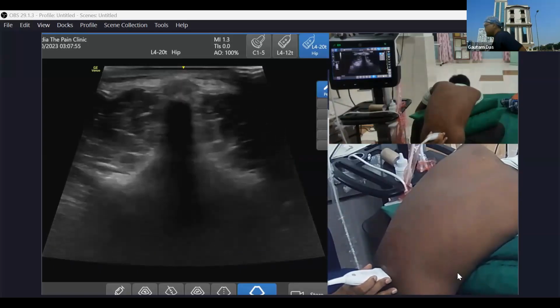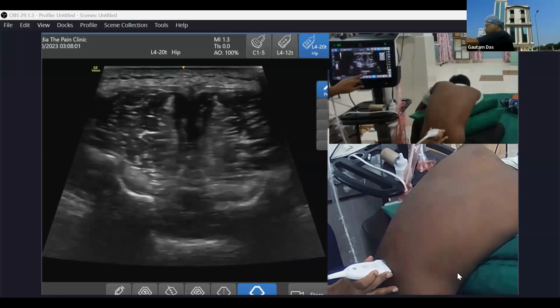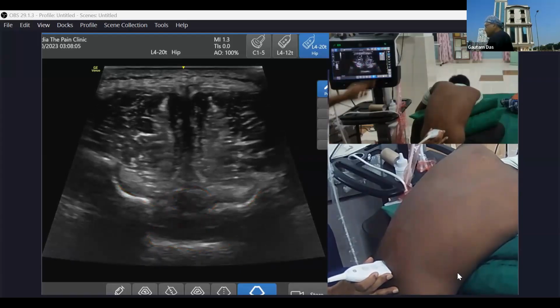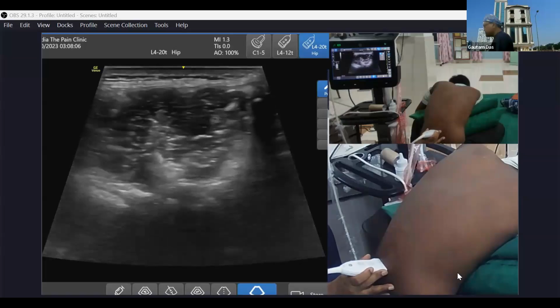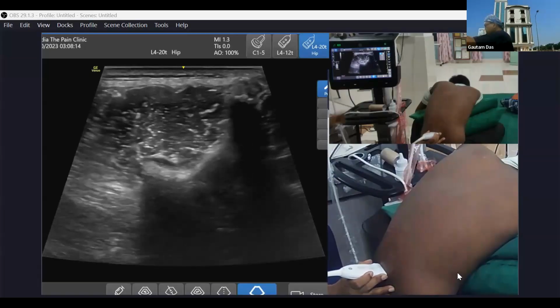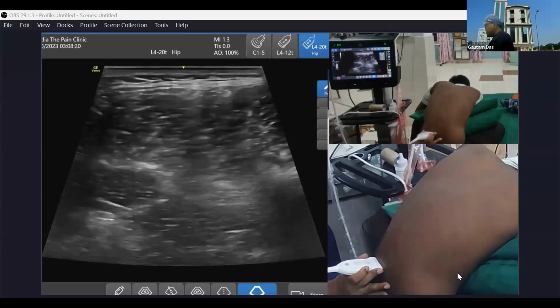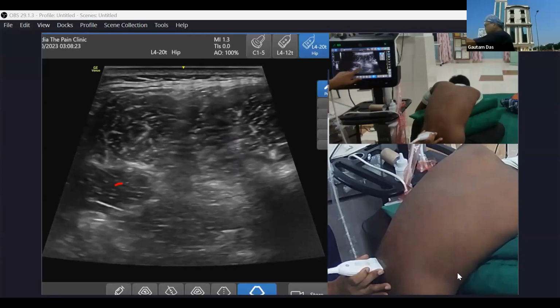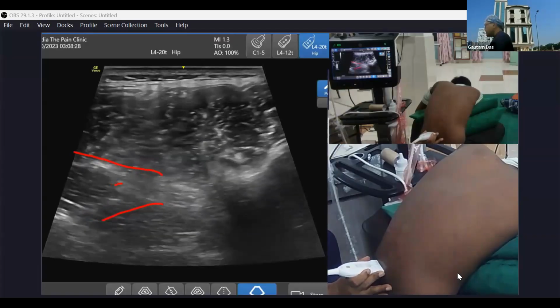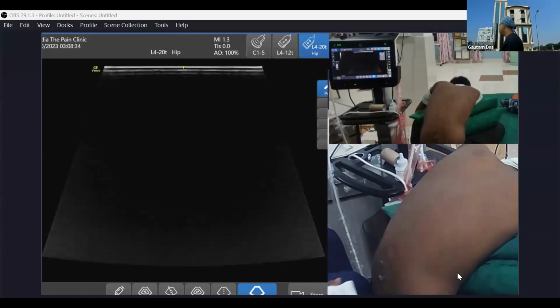So, just a quick recapitulation. I was here. I can see this is the bat's view: anterior complex, posterior complex, lamina. Then I'm going laterally. I can see the transverse process for the medial branch block here. If I'm toggling above and below, I can see some break there. That is your intra-articular facet joint injection. If I'm still going laterally, I can see this is your QL muscle, between the two layers of the thoracolumbar fascia. And above that is your erector spinae group of muscles. Is it clear to everybody?